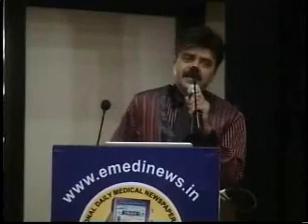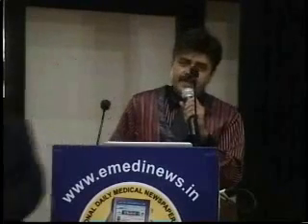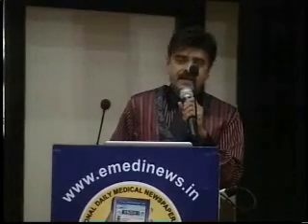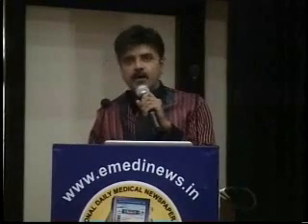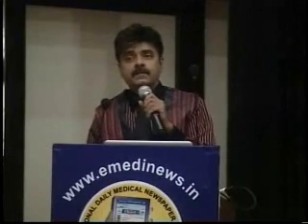Imaging as such can be categorized into three categories: anatomical, physiological, and biochemical imaging. Anatomical imaging modalities we all are aware about: X-rays, CT scan, MRI, ultrasound, angiograms are anatomical modalities of imaging.